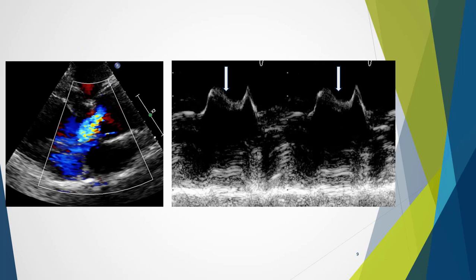Here we can see a very posteriorly directed aortic regurgitation associated with a bicuspid valve. The flow moves directly down and hits the anterior leaflet of the mitral valve — a good example of the Austin Flint murmur. We can also see this represented on M-mode: normal mitral movement profiles are present, except for this component showing fluttering and thickening of the mitral valve, where it is trying to open but is simultaneously being forced downwards by the aortic regurgitation.